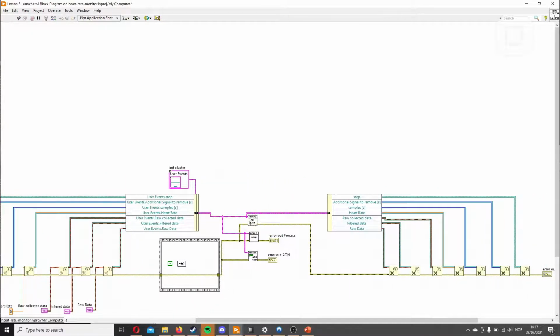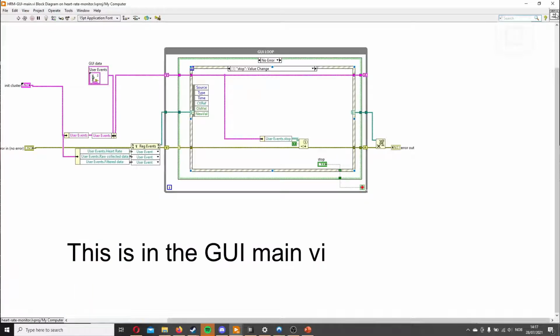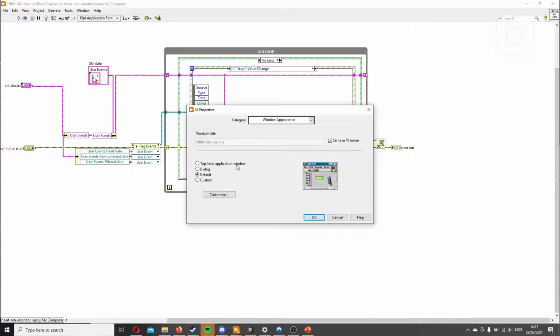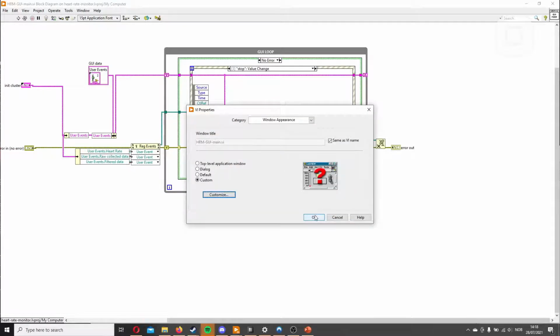But we have an issue now, because this is the front panel which will show if you run it now. And that's not good. We want the GUI to be shown. So what we'll do is go into VI properties, window appearance, and we can just choose the top level window. This will automatically show the front panel when called, and close it after it originally closed. Show front panel when loaded just means when you open the application, not even run it, and we don't want that, so we'll cross that out. But the rest of the functions here are fine. There is also a better way to do it, doing it programmatically, but for our case it doesn't really matter.